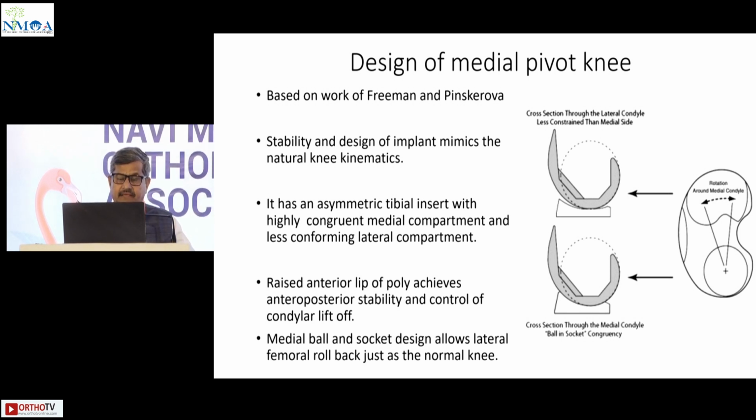A raised anterior lip of poly achieves anterior posterior stability and control of condylar lift-off. The medial ball and socket design allows lateral femoral rollback just as the normal knee. On the medial side, it moves about 3 to 4 millimeters. On the lateral side, you have excursion almost up to a centimeter. 7 to 11 millimeters it moves posteriorly on the lateral compartment.